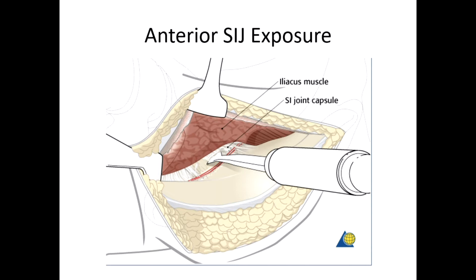The second thing I want to talk about before we go to the specimen is the anterior approach to the SI joint. I find this particularly helpful — I probably use this 90% of the time versus a posterior approach for reduction. There are some limitations: if you have an injury to the anterior sacrum, which is common with lateral compression injury, it can be very difficult to instrument the sacrum from the front. But for a pure SI joint dislocation, this can be a very good approach.